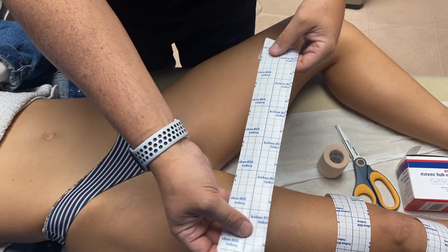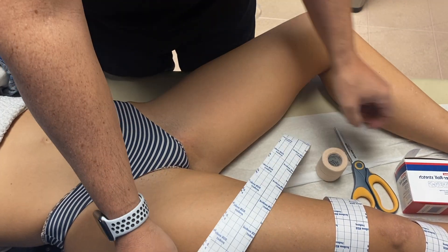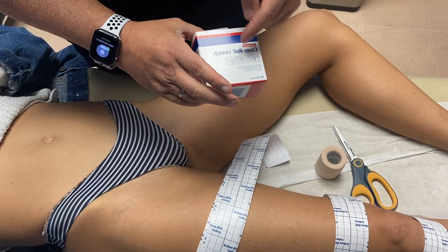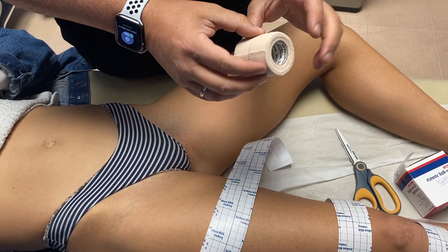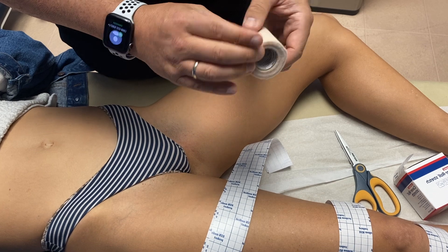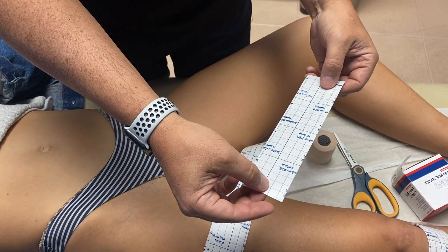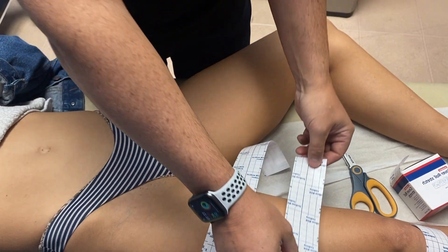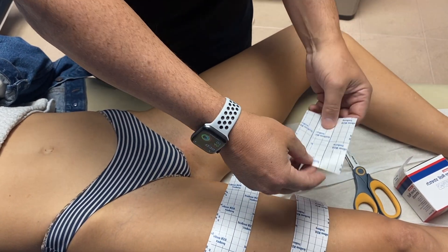We're going to have nine squares — 18 inches of cover roll stretch. Cover roll stretch is what the box is labeled. We're going to have a roll of two-inch wide Elasticon by Johnson & Johnson. We also have another strip of cover roll stretch that's four squares or eight inches, and then two smaller strips that are two squares or four inches.